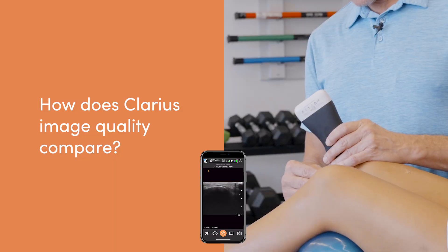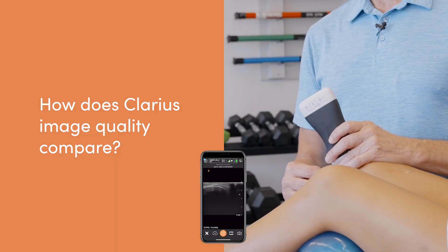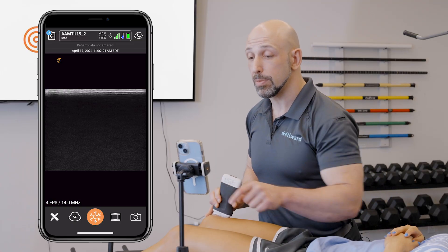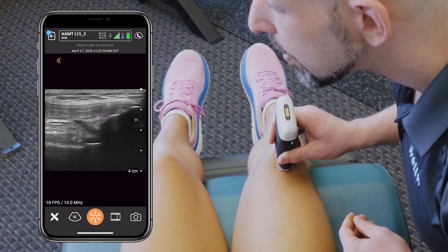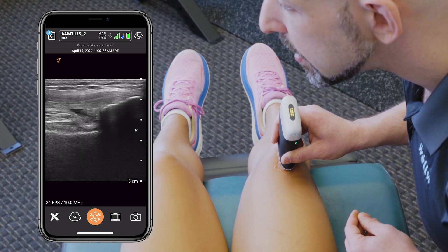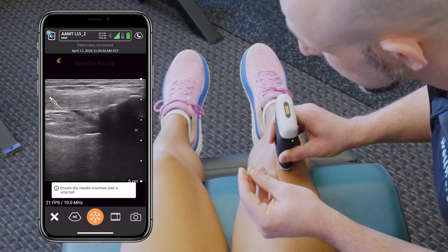I enjoy it and use it quite a bit. I've used a variety of handheld systems, and Clarius does well — especially once I learned the knobology and figured out how all the settings work. At first I would just put it on and it would produce a great image without me doing anything. But once I figured out how to use the different modes, the image quality was impressive.